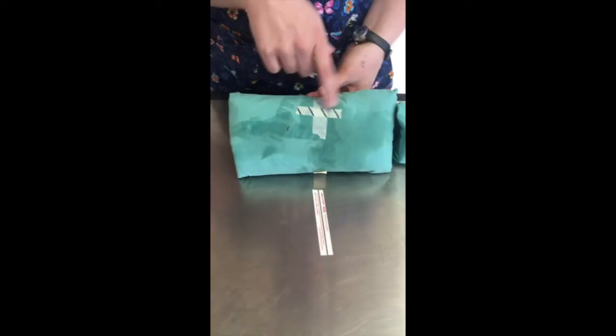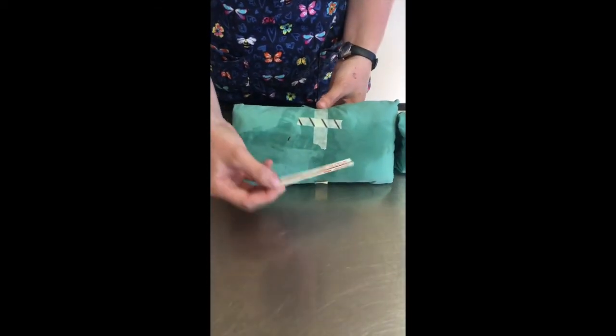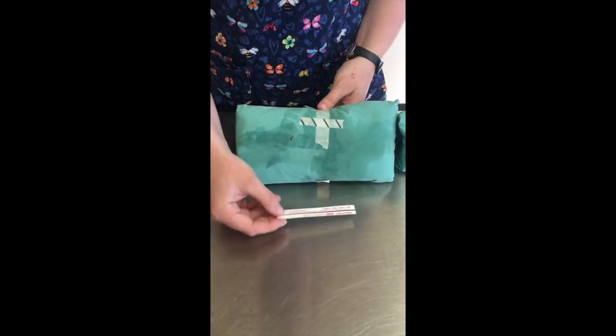If you move over to a pack that has been autoclaved, you can see that the tape does have black lines on it, and if you were to open this pack, the indicator strip would have a black line indicating that yes, this has been properly autoclaved and is sterile.